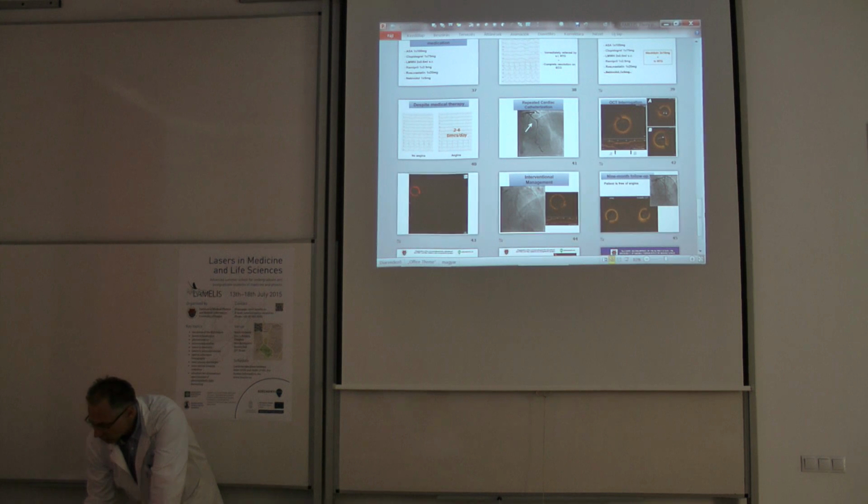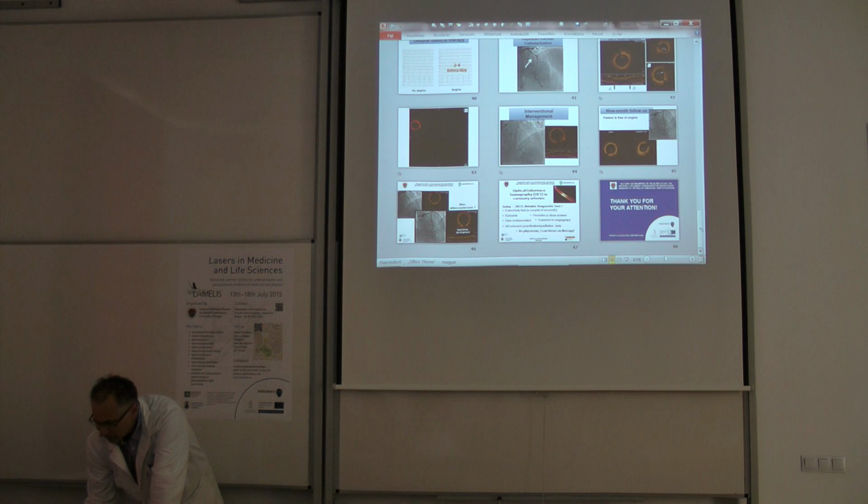Of course, we show those examples when we are perfect with this image generation. But sometimes, and this happens in most of the cath labs, the first pullback run is not successful. So we didn't displace the blood, we didn't image all the arteries that we are interested in. So we have to repeat it maybe 3 or 4 times. That means 4 times this 15 milliliters of contrast, 60 milliliters of contrast, that might kill the patient's kidney.